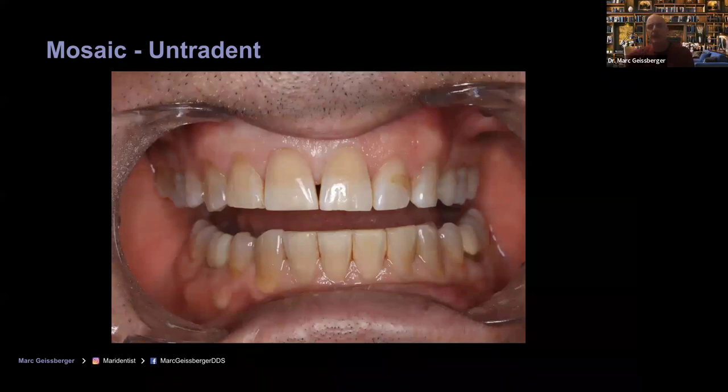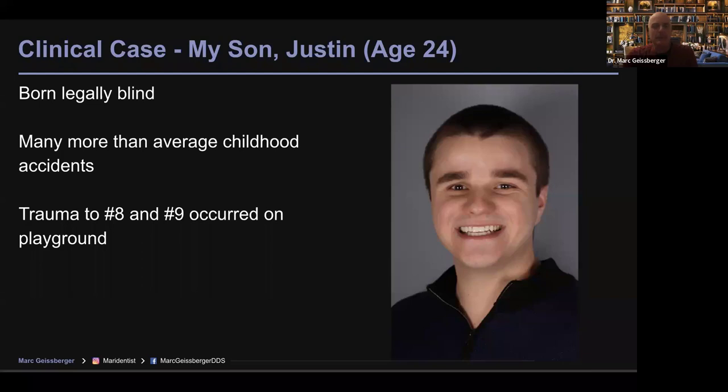Now, when you do that and you just use one shade like this enamel yellow and you polish it with the Jiffy Naturals, you'll get a result that is lifelike. Now, as soon as I got this all smoothed off, the patient's like, wow, this is amazing. What are we going to do about this one? I'm like, well, there's minor chips. We could smooth that as well. But the patient saw that too, said, well, this one looks perfect. Now the one next door doesn't look so great. But I'm not going to sit here and bond these. I would just do a little enamelplasty if we wanted to.